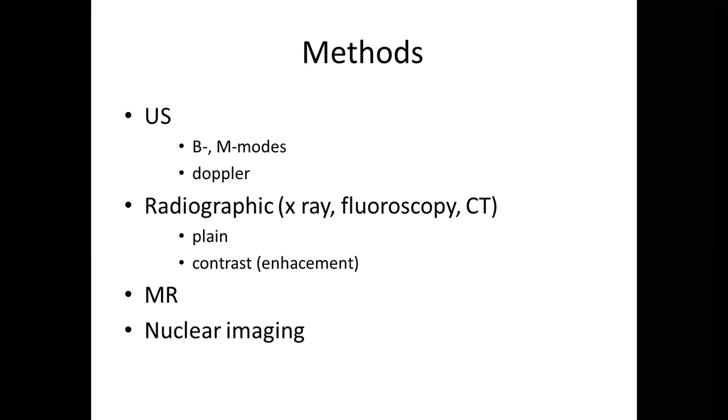Both of them follow different aims. Each has its own objectives, but it is hard to evaluate the heart condition, vessel condition and movement, like the blood flow movement, its direction, and the intensity of the jet, without each other. Next are radiographic techniques, and we actually use a variety of them.